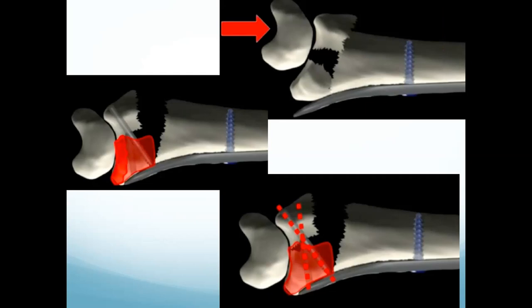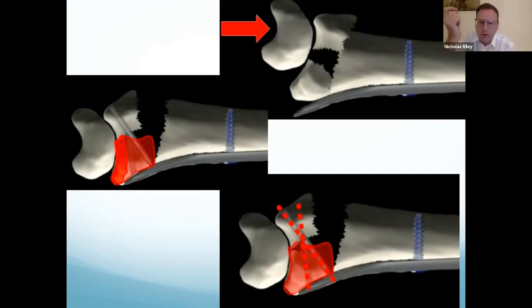People, do you do bone grafting? What people get concerned about is... what I would say is that a useful thing to remember is that you can still use dorsal K-wires here as a temporary reduction tool. So I'll often do a dorsal Kapandji technique to reduce this fragment before fixing it through the plate. And I rarely bone graft, which I think was the next question.